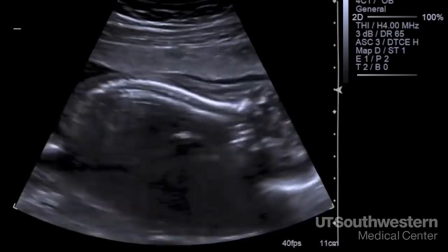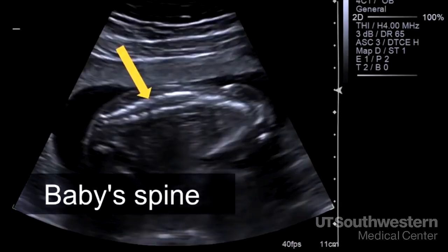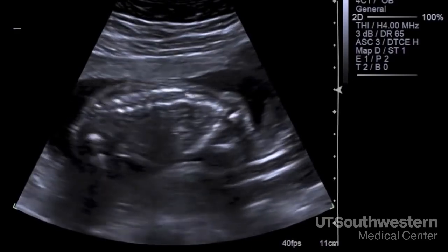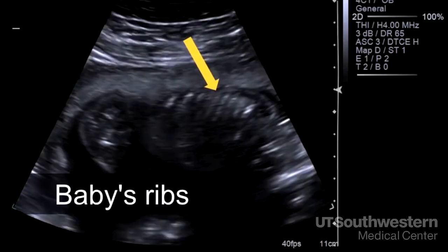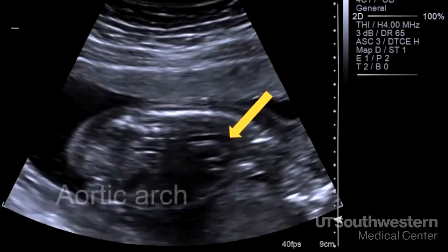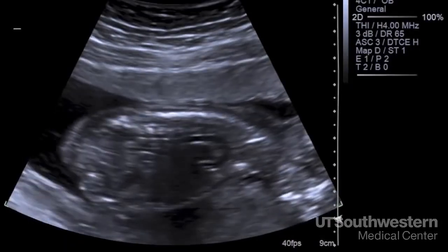This is the spine. We look at the region of the neck, the middle of the back, and all the way down to the sacrum or tailbone where it comes to a V. These views help us detect spina bifida. You can also see the ribs coming off the back. With the spine up towards us, we can also see some of the big blood vessels in the baby, like the aortic arch, the black candy cane-shaped structure in the chest.